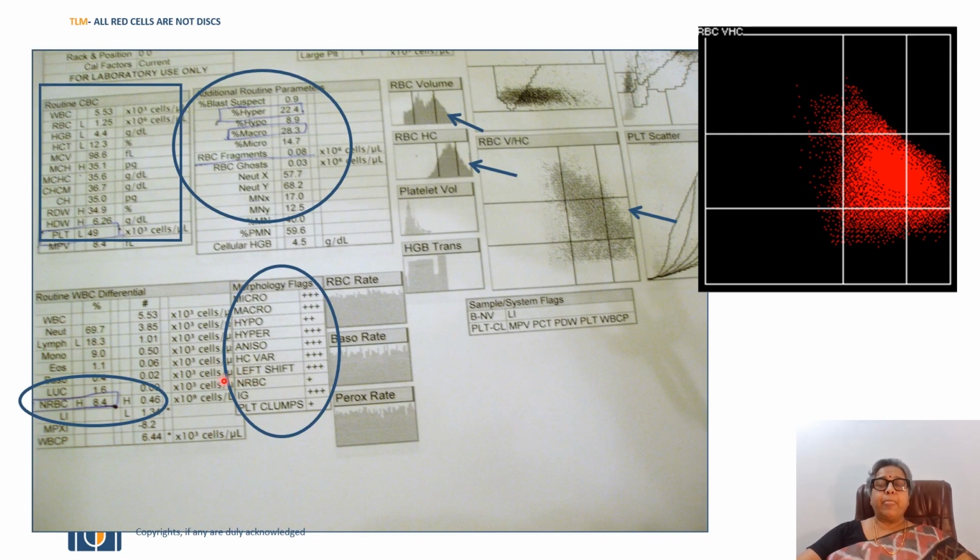So let's take one example. This is a patient with a hemoglobin of 4.4 and an MCV which is fairly normal, and an MCHC which is slightly higher. Platelets are low. There's macrocytosis. So there's a very wide scatter. There's a move to the right. There's macrocytosis, most of which is normochromic, and there's also some microcytic and some hypochromic cells. So if you look at this, there are macrocytes, there's hypochromic and there's hyperchromic.